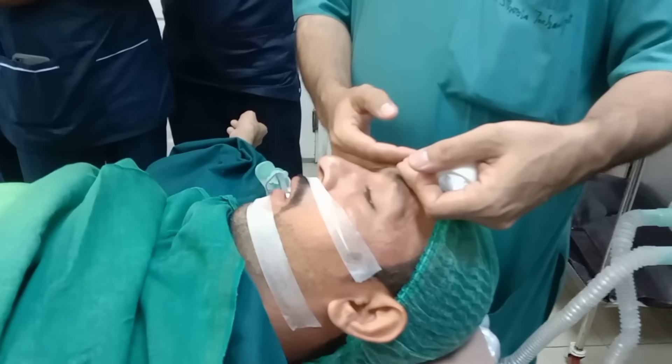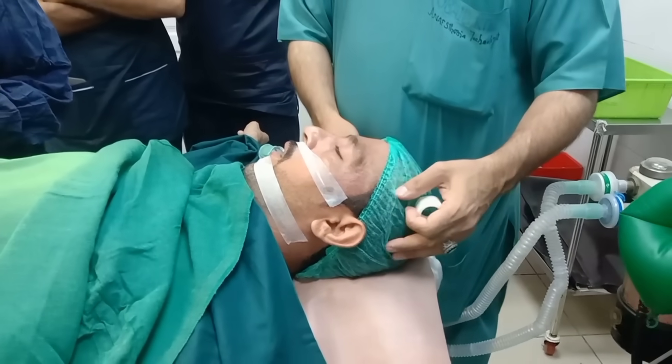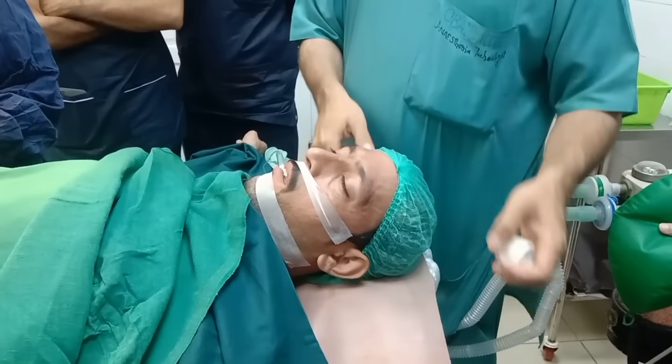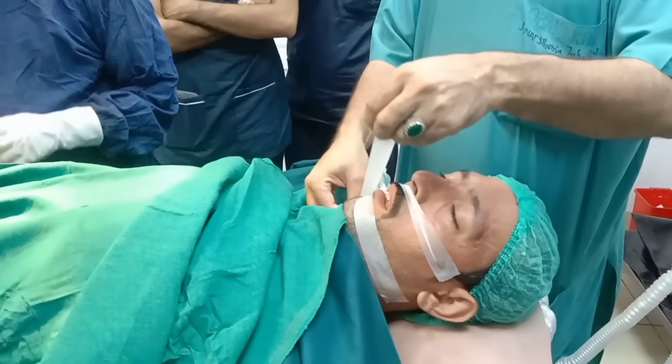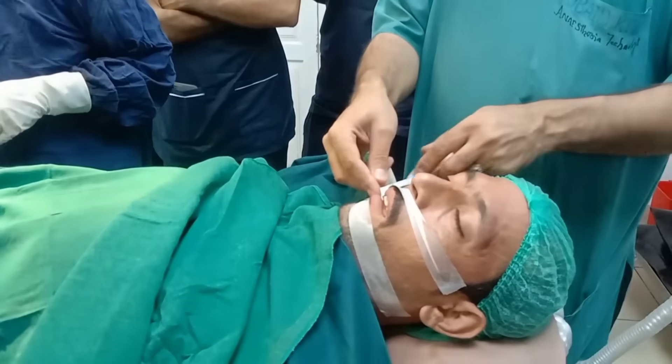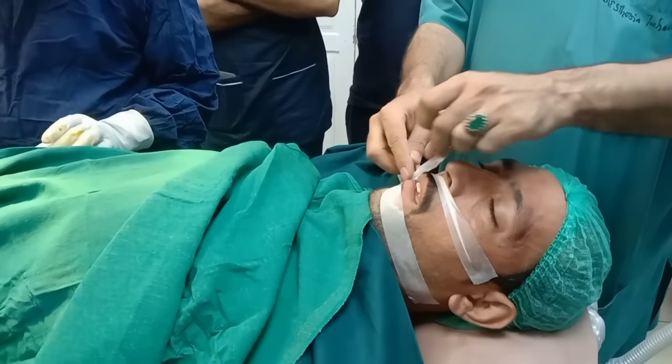Completion of the procedure. Once the surgical procedure was completed, I gradually reduced and then stopped the inhalational anesthetic agents. I continued to give the patient 100% oxygen to wash out the anesthetic gases from the body.